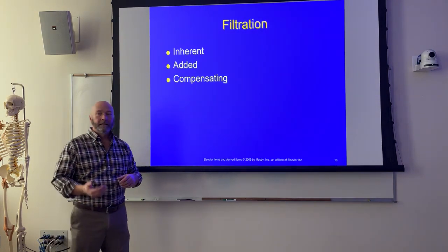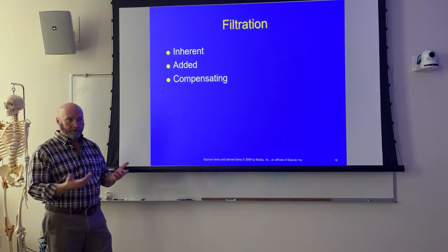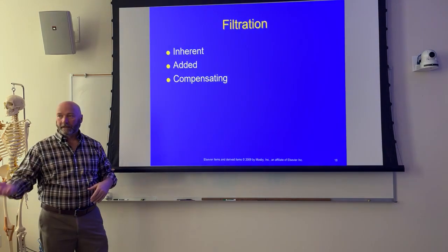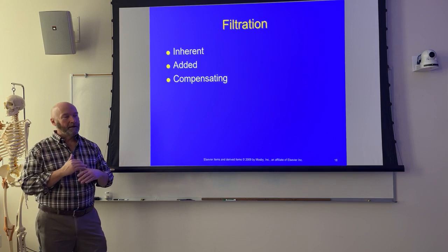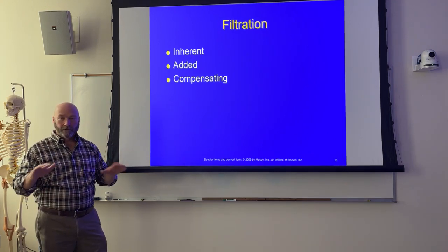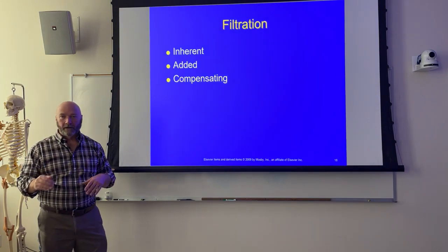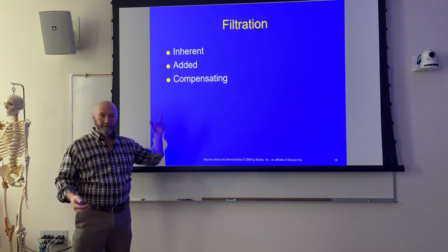But if it doesn't, then we have to add more aluminum, right? But that's still inherent filtration, because we can't expose human tissue with anything less than 2.5 millimeters of aluminum, okay? All inherent filtration. You can't remove any of that and legally make an x-ray, okay? Everybody okay with that? Anything that you have to add to get to that 2.5 millimeters of aluminum, we're still going to call inherent filtration, okay? It's anything above that becomes added filtration.